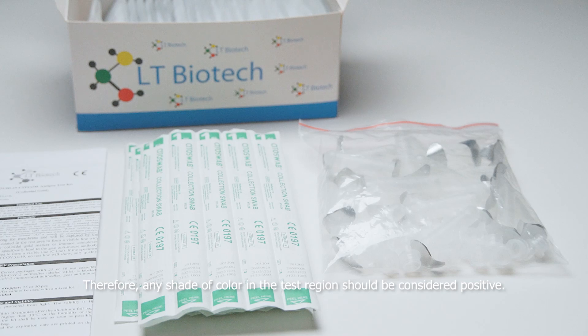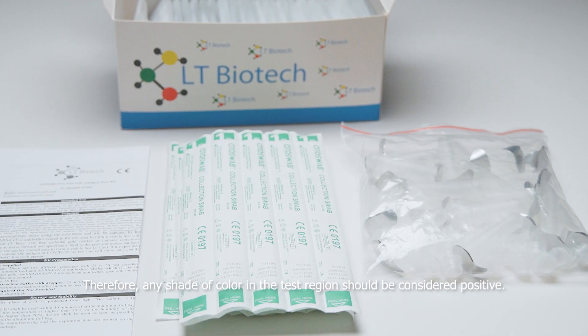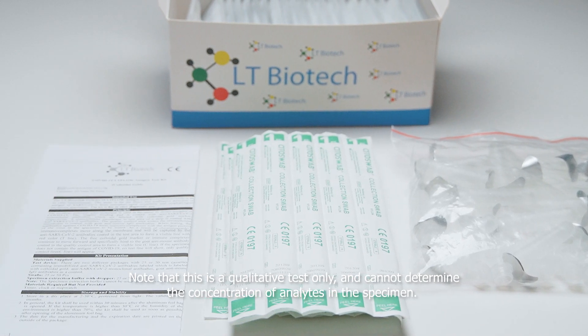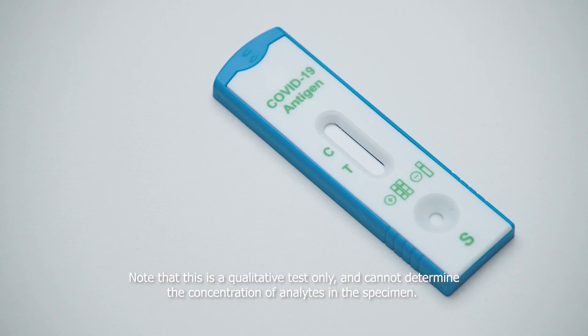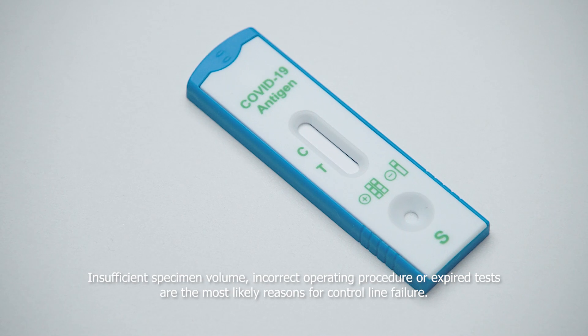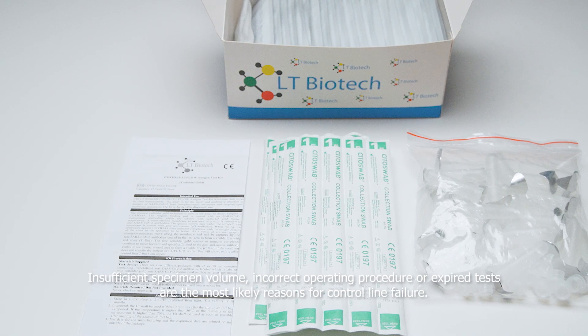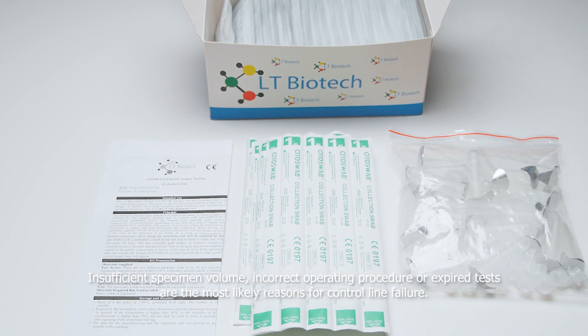Therefore, any shade of color in the test region should be considered positive. Note that this is a qualitative test only and cannot determine the concentration of analytes in the specimen. Insufficient specimen volume, incorrect operating procedure, or expired tests are the most likely reasons for control line failure.